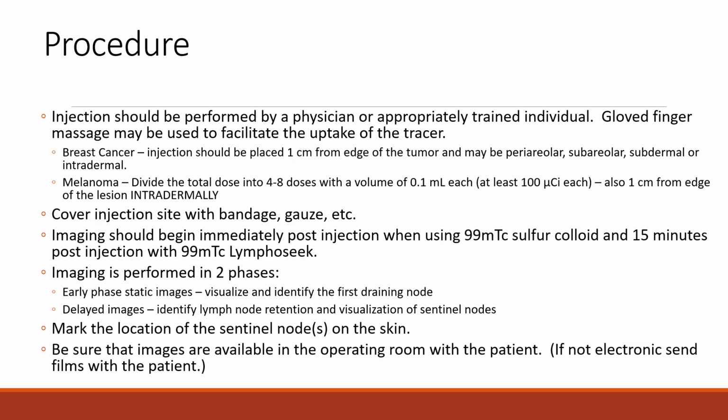The procedure for all of these, sulfur colloid and Lymphoseek: the physician or appropriately trained individual really has to get that injection right. They really have to know what they're doing, or else they screw up the whole study and they don't get accurate results for the patients.